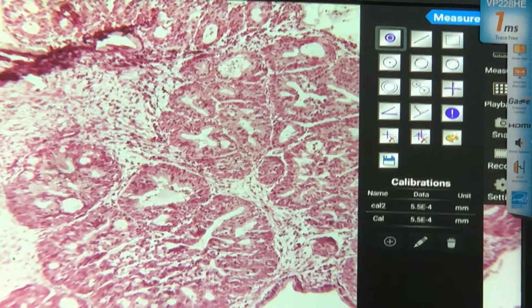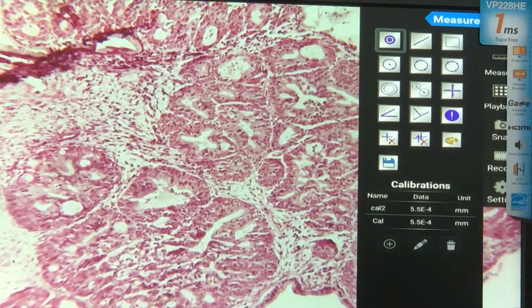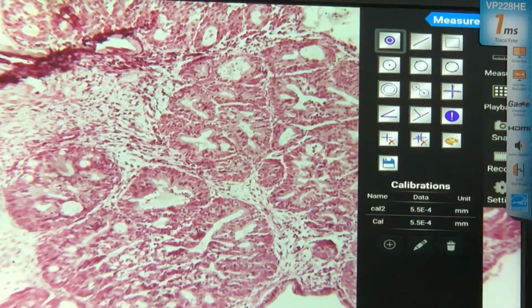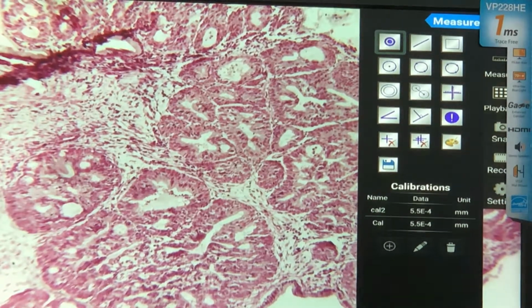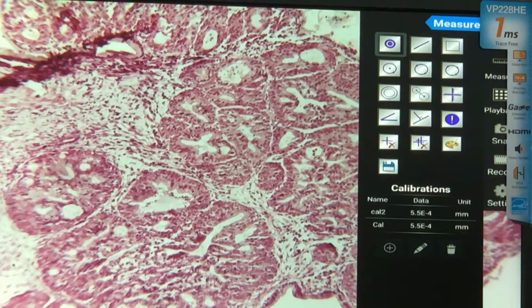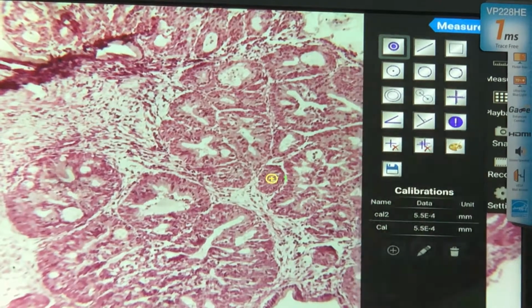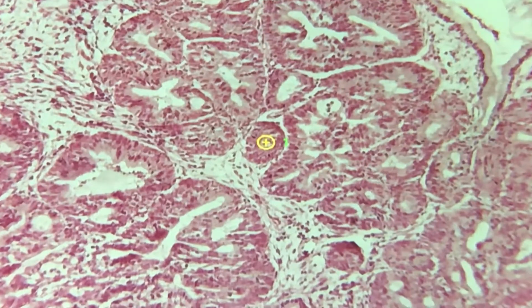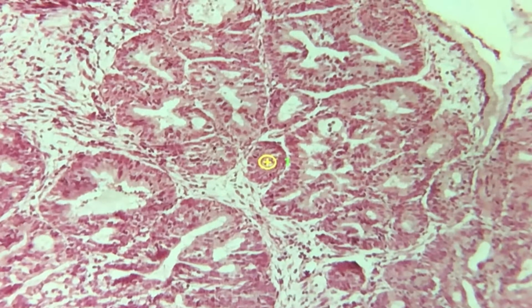You will see those endocervical cells that are lined by, normally, columnar epithelium, but here you will see those nuclei, those violet things inside, increase in number. So instead of one layer, you will see plenty of layers, 4 or 5 layers. In this one, I see 3 layers. And you would note this, identify these significant pathologic changes which I pointed at the tip of pointer 1. So that is the squamous metaplasia.